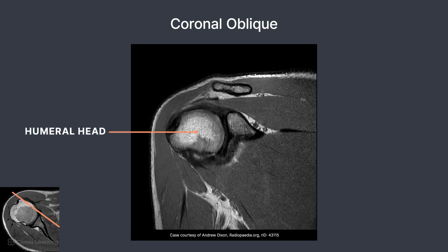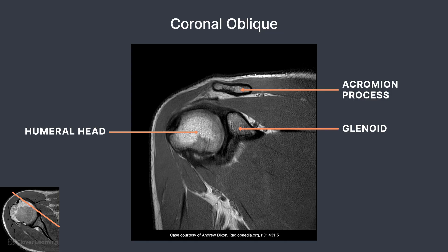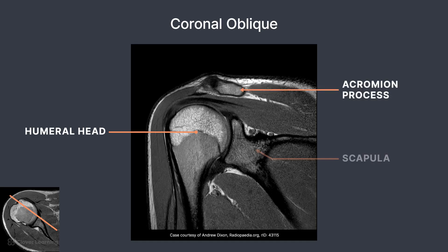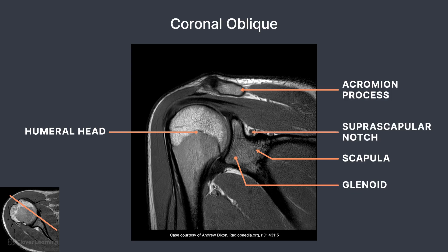Moving posteriorly, the humeral head begins to emerge, as well as the articulation with the glenoid portion of the scapula. Superiorly, the acromion process of the scapula is demonstrated. As the slices approach midline, there are several important structures to note. Bony structures visible include the humeral head, acromion, and scapula. Specific parts of the scapula visualized here include the glenoid and suprascapular notch.